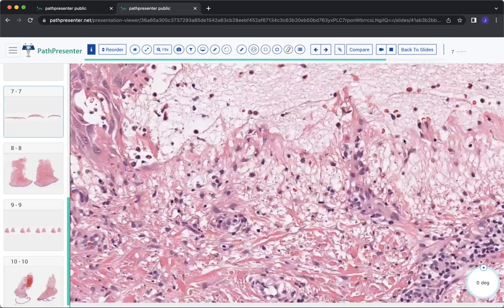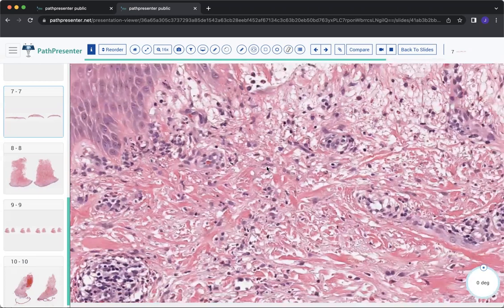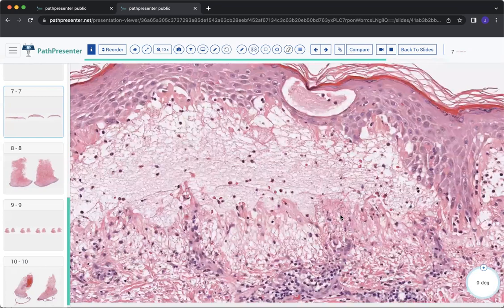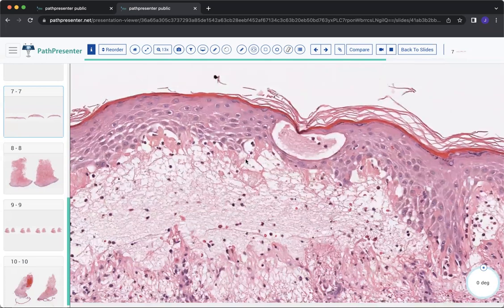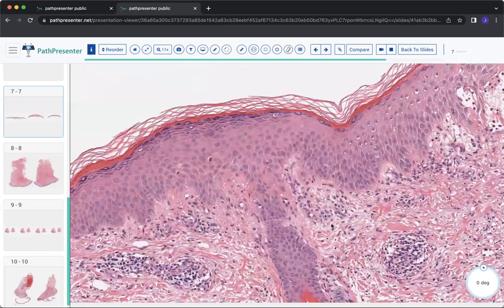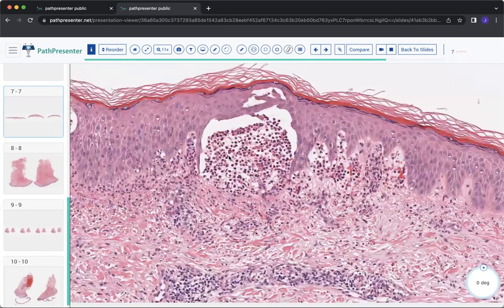You can even have a little bit of lymphocytic inflammation here, neutrophilic inflammation. It's going to cause degeneration and death of the keratinocytes eventually. But even just the detachment, how long it's been detached, is going to cause necrosis. As you see, it's just starting to die off here. But the way you're going to get the clean diagnosis is by finding those neutrophilic microabscesses over here on H&E.